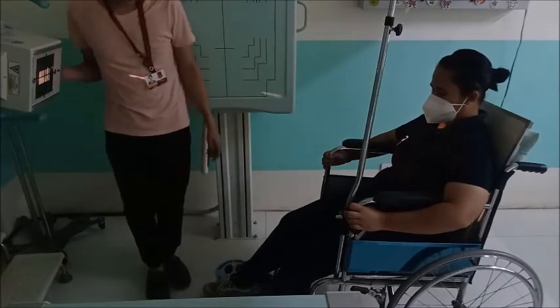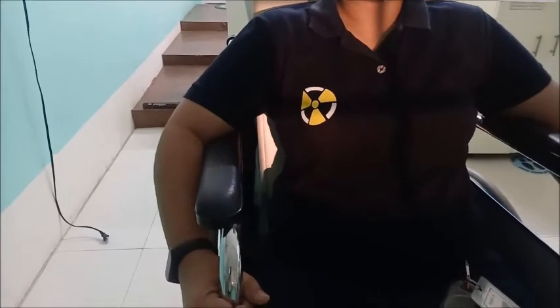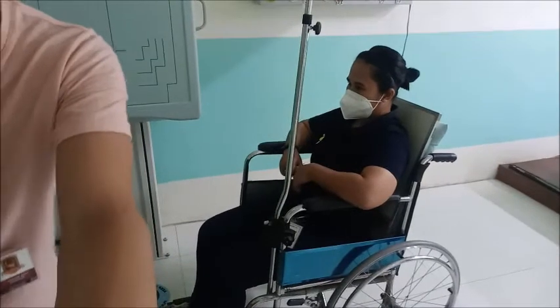From top to bottom, adjust the top portion and then the bottom part. You can see the shadow of my finger within the collimation field. Then adjust the lateral sides too, so the shadow of my finger reaches the edges of your collimation. This is radiation protection: I need to avoid overexposure of the patient to radiation.